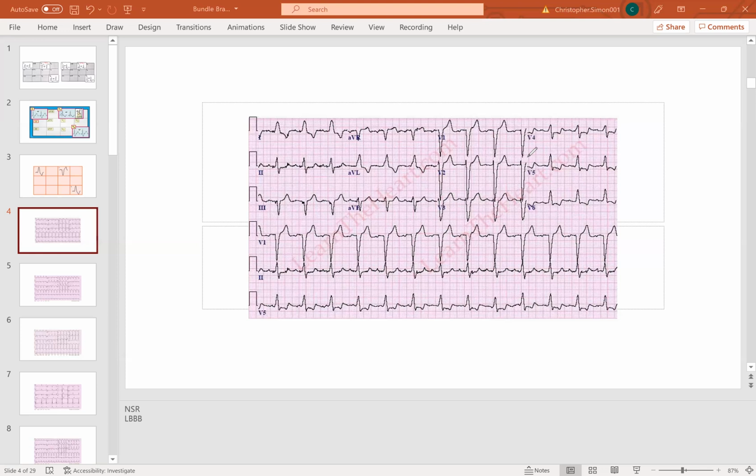Because the next question I would ask myself in my progression is, is my QRS narrow or wide? Remember how I taught you guys to ask yourself questions about what you're looking at: do I have a P wave? Do I have a P for every QRS? Do my Ps have the same morphology? Is my PR interval within normal limits? Is my QRS narrow or wide? Now we're coming to the part where this information I'm gathering is starting to mean something. In this particular case, my QRS is wide. I don't know why, we'll figure that out in a little bit.